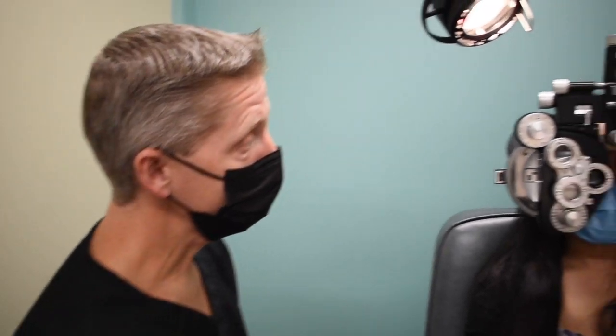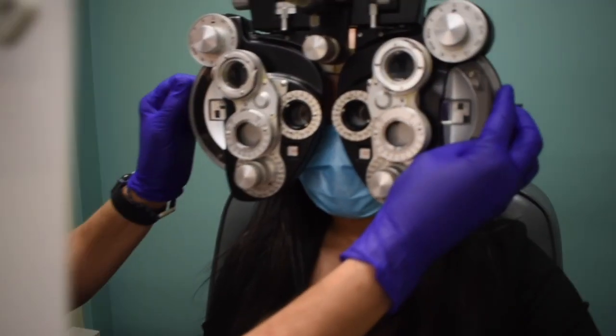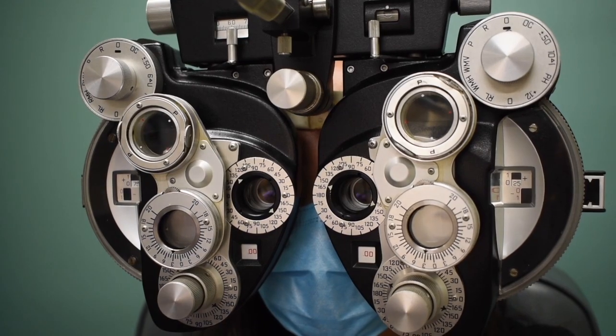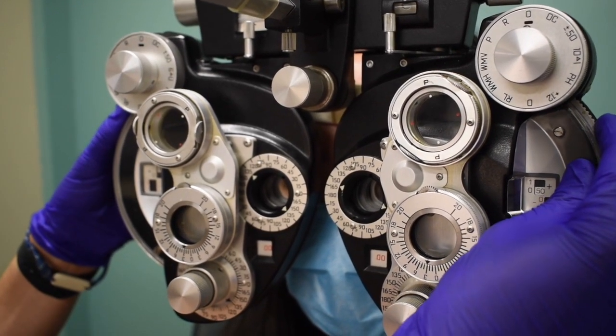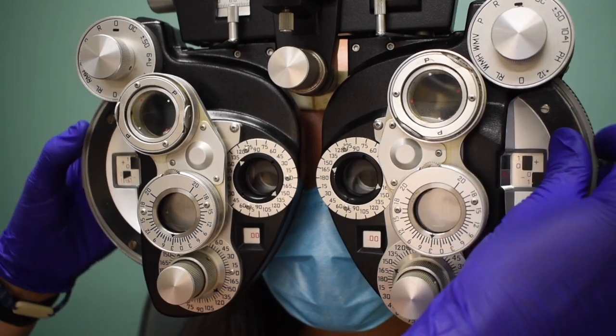The other method is the fused cross cylinder. We did that a moment ago. We did it last lab, but I'm going to reiterate that for you. Okay, so here we've got our patient in here. I'm going to put her BSBVA back in place, so we're going to start her out with plus 3/4, plus a quarter. I have my target with the letters on it. I'm going to have her tell me when the letters get so blurry she couldn't make any out at all. Again, we're going through really an NRA where we're blurring out her accommodation totally.